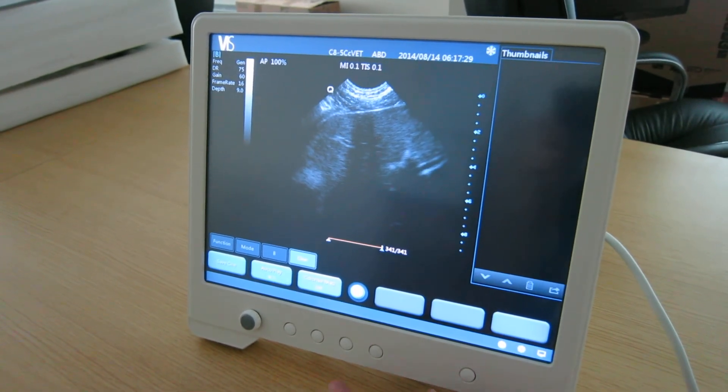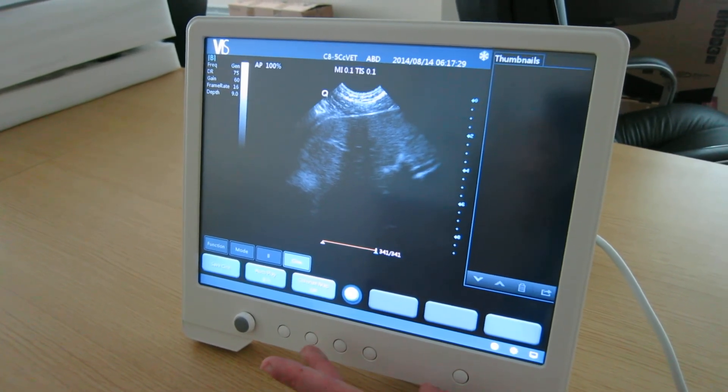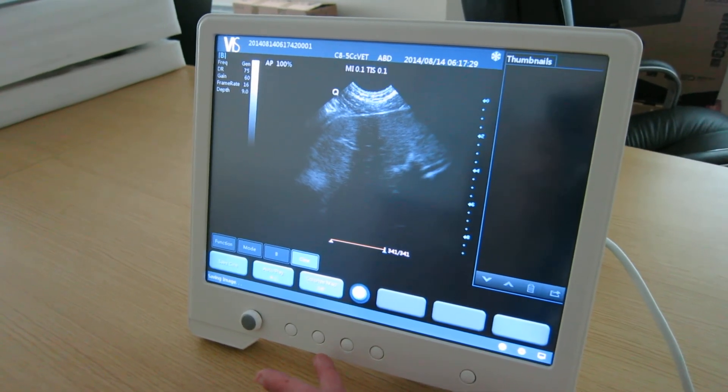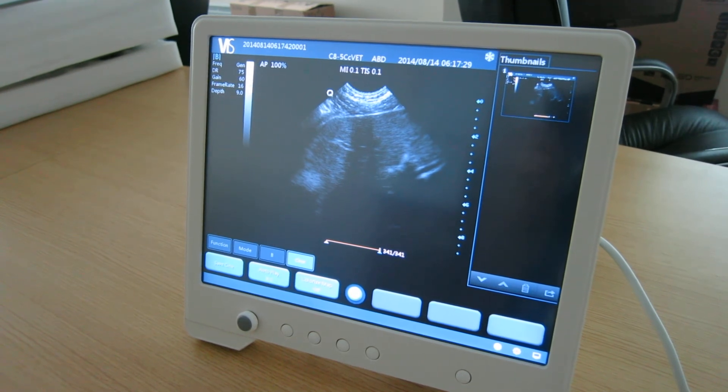One touch button for freezing the screen. This is saving the image — as you can see, the image is saved in the top right-hand corner. Very easy to use.